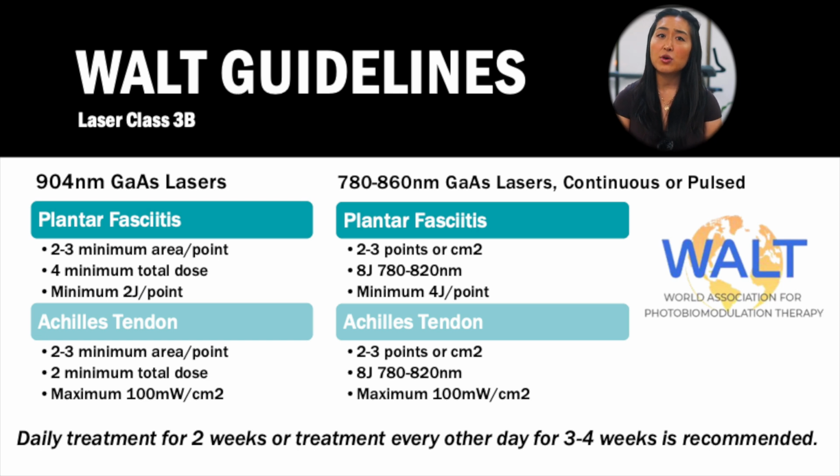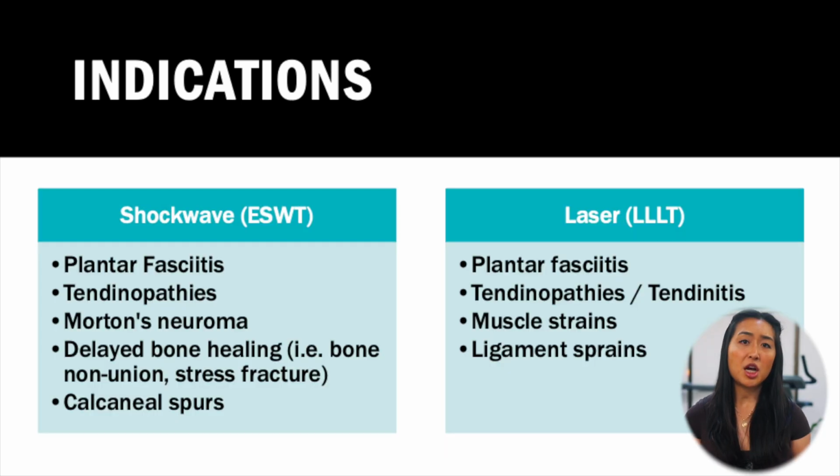Therefore, simply from the dosage perspective, it seems to be much more feasible, both for patients' time and costs incurred, for patients to be getting shockwave therapy once a week versus laser therapy daily for the same length of time. So let's talk about the indications for these two modalities now.